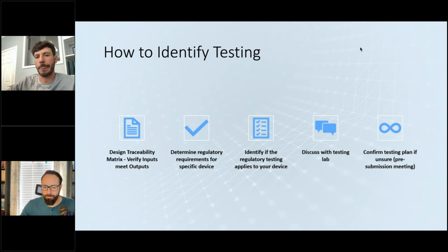Awesome, thank you. And yeah, the DMR, DHR wasn't covered a ton in here, but it does overlap a good bit with the DHF side, right? So a lot of these design control items for developing a new device are part of your DHF, but then that leads to your DMR, which is kind of the specifications on how to build each device. And then the DHR is the actual record of you building and releasing that device, in the scope of software. So lots of overlap between the DHF, DMR, DHR. Lots of overlap and lots of acronyms. Exactly, lots of acronyms. Or abbreviations, I mean.